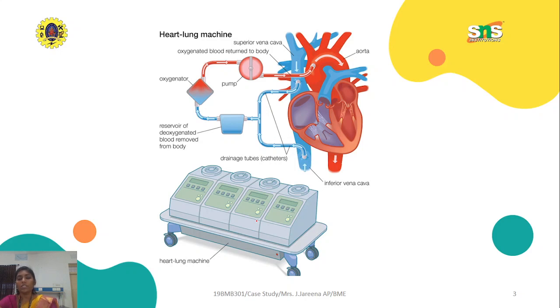The heart is the main thing, because by means of the heart the blood is distributed to the other organs, so that they keep functioning properly. If you operate in such a case, it will disturb the other organs in some way, so the mortality rate of cardiac surgery or bypass surgery is higher. By addressing this particular problem, the heart lung machine has come into the picture.